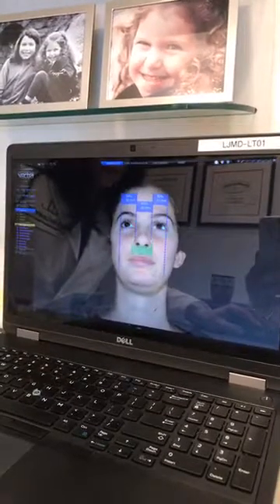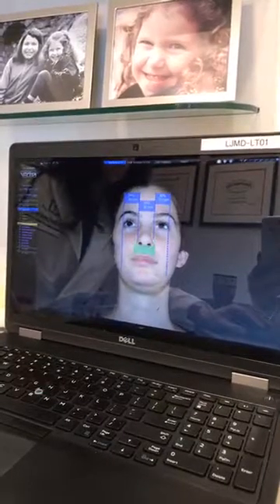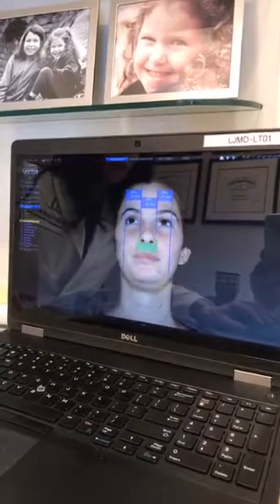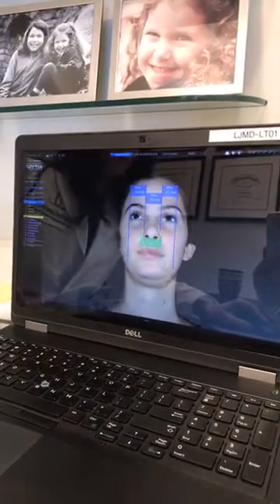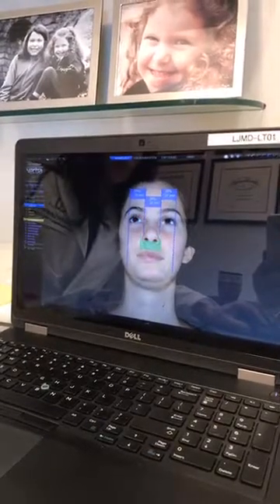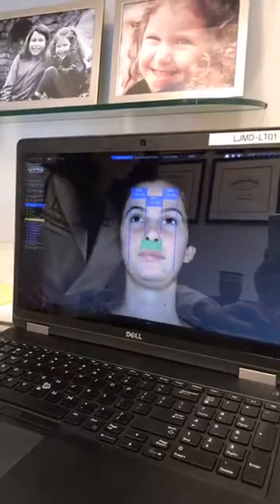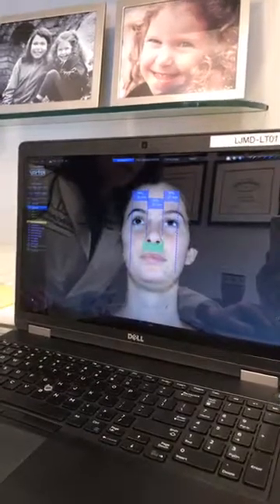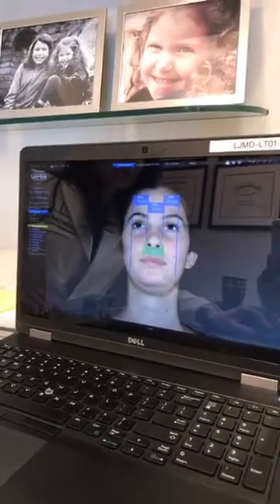Now, on the vertical projection, the face should be broken up into fifths. What this program does is focus in on the middle fifths of the face, and again we're looking for these to be fairly similar. As I already commented, the left side of her face is a little bit smaller than the right side, which is visible even in her eyes. So we have 34, 34, and then 30, so the left side of her face is a little bit smaller.